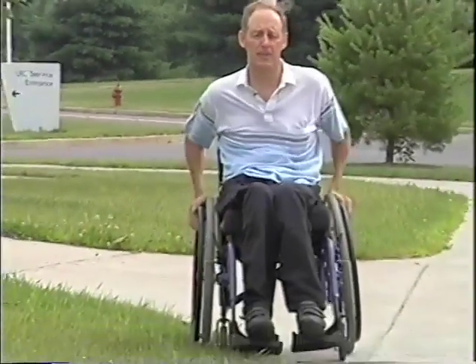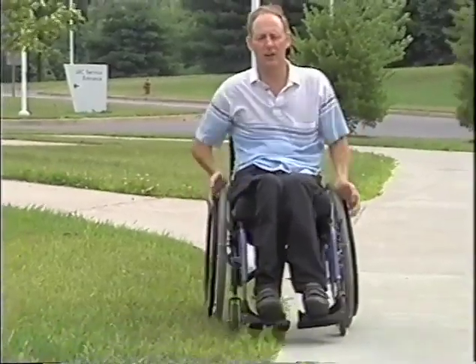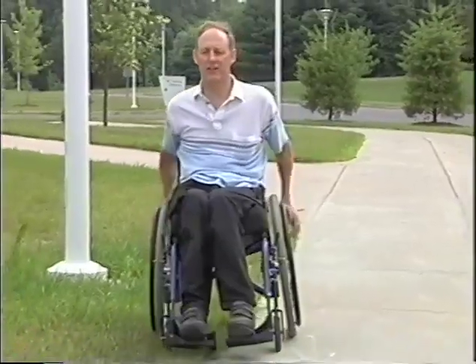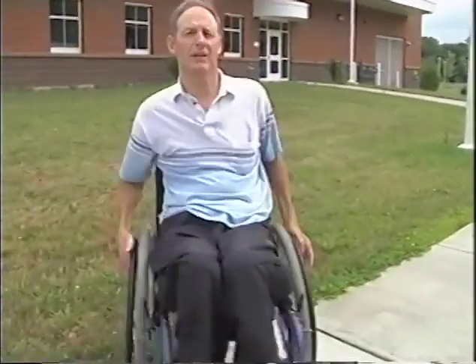One little trick when it comes to slanted sidewalks is to put your uphill wheel on the grass if you can, and this will keep you going straight. Now I grant you this sidewalk is not very slanted, it just happens to be the best we could find here on this campus. But if you can keep your uphill wheel on the grass, it'll help you not have to fight the downhill pull of a slanted sidewalk all the time.